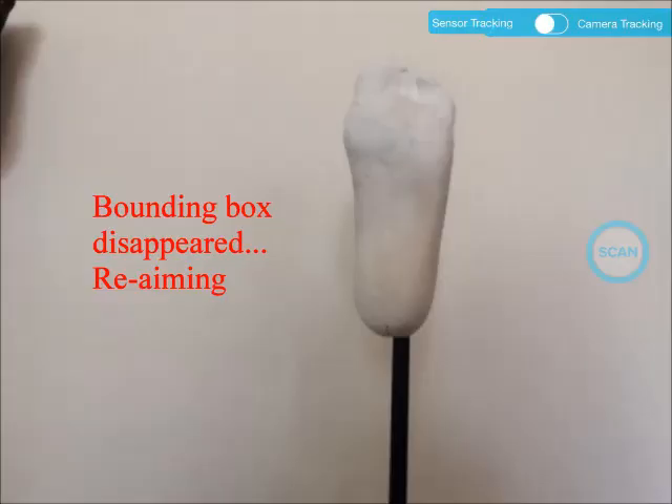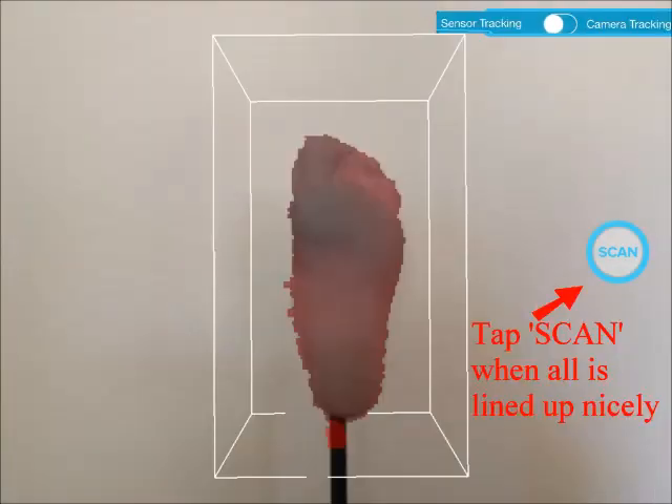During the aiming mode, you may temporarily lose the bounding box. When that happens, just point the scanner to a different direction, then come back. Once the bounding box is visible, make sure the box is in good size and the dark red patch covers the whole foot. The dark red patch flickers. If the box or the red patch does not cover the whole foot, the foot may be out of the box, which should be avoided. When all is good, you tap the scan button.